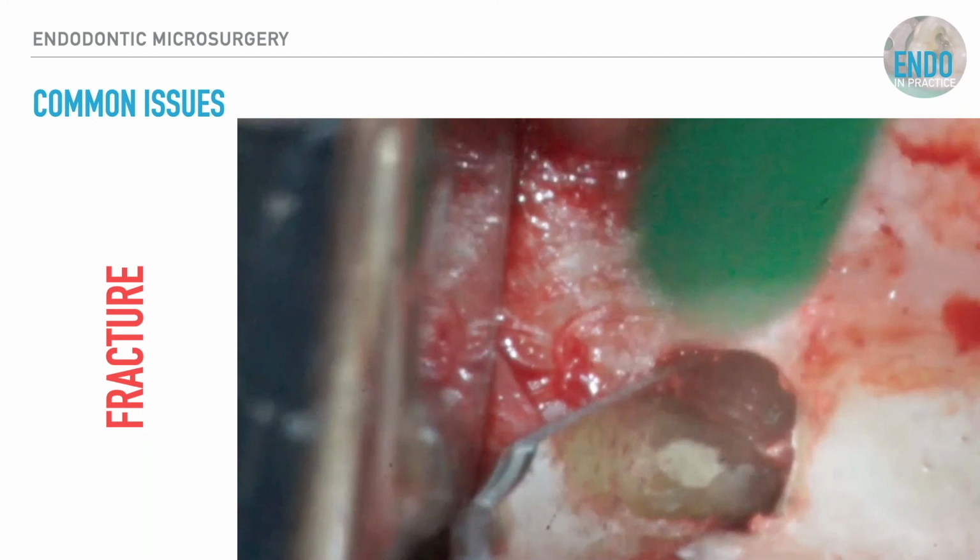As I said, you're using very gentle, light pressure, and we know that the ultrasonic preparation won't create a fracture, but if a fracture is there, it may propagate it. So in that case, we're putting a root end restoration on anyway, and really we're counselling the patient on rapid alternative prosthetic options.